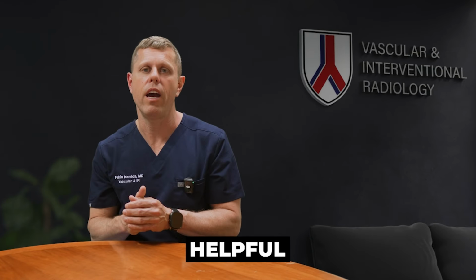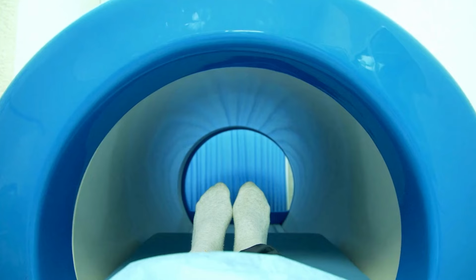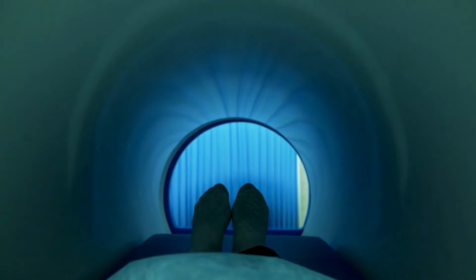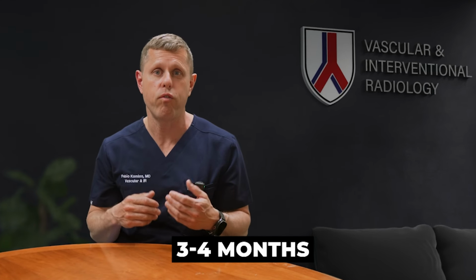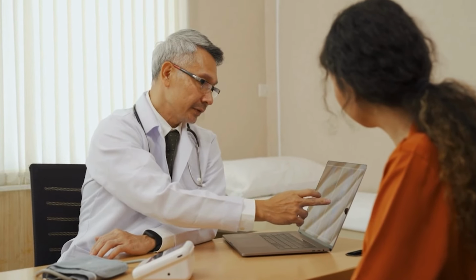And I think it's very helpful because in some cases it can show us that we didn't treat the whole tumor and that another treatment is necessary to treat a different blood vessel that may be going to a small part of the tumor that we didn't see before. The findings on the immediate PET, in my opinion, also correlate very well with the outcomes. We then repeat imaging in 1 to 2 months and we already can see some results, although the maximum results will still take 3-4 months to take effect. And we will continue to follow with you as necessary to determine if another treatment may be necessary or not.